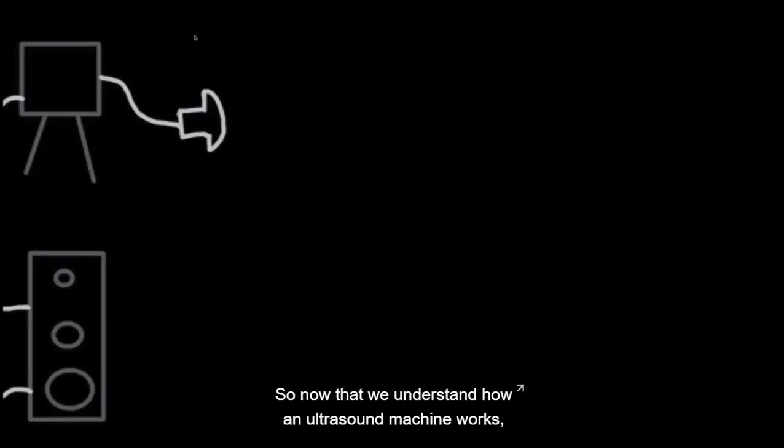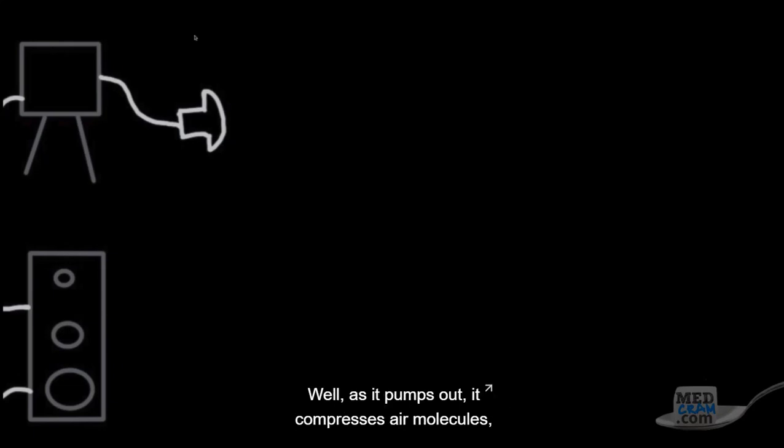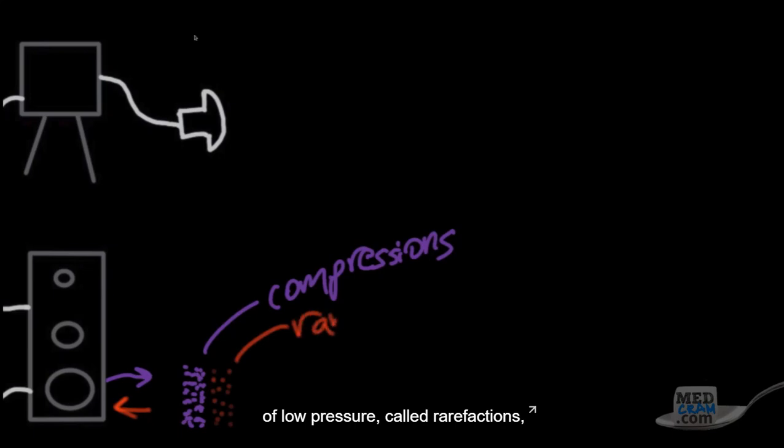So now that we understand how an ultrasound machine works, let's return to our discussion of ultrasound physics. As we touched on before, as the speaker pumps in and out, it generates sound waves. Well, how does it really do this? Well, as it pumps out, it compresses air molecules. And these areas of highly compressed air molecules are called compressions. And as it goes back in, it creates this vacuum effect. And there's areas of low pressure called rarefactions.